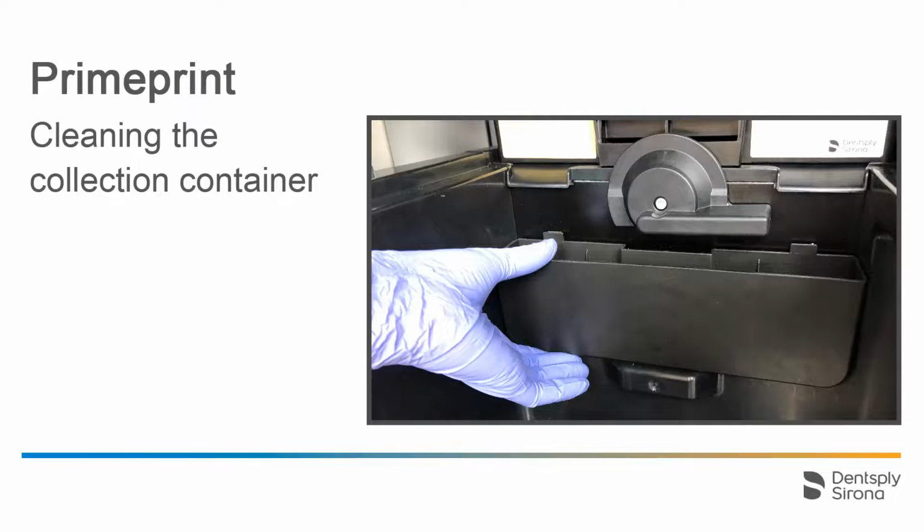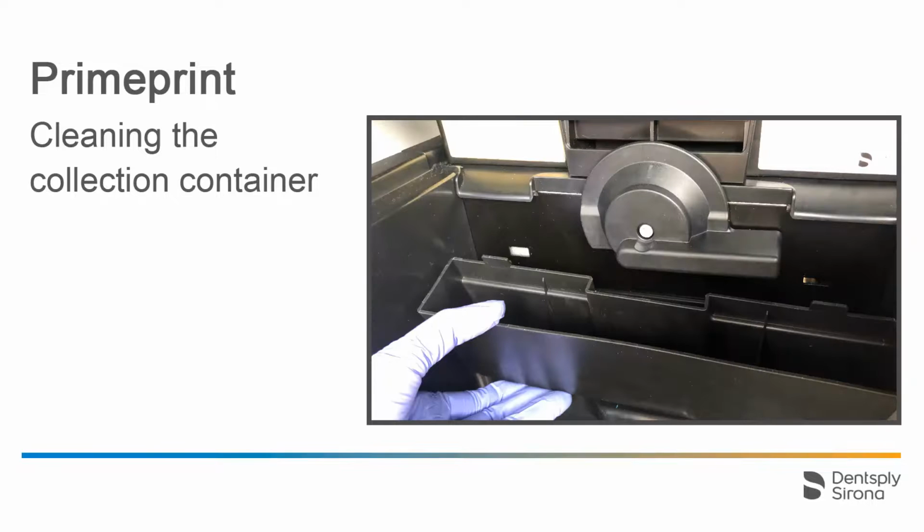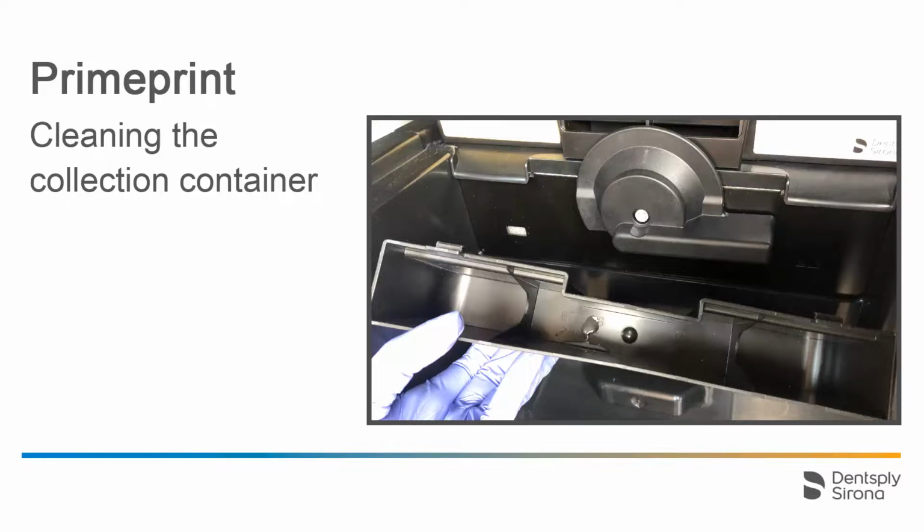The container is designed so that the compatible vat contents of the material can be accommodated. As a rule, the vat cannot empty itself completely, but it is nevertheless possible that some resin ends up inside the container. In this case, do not use the resin anymore. Remove the collection container and clean it with a paper towel, followed by some isopropanol.